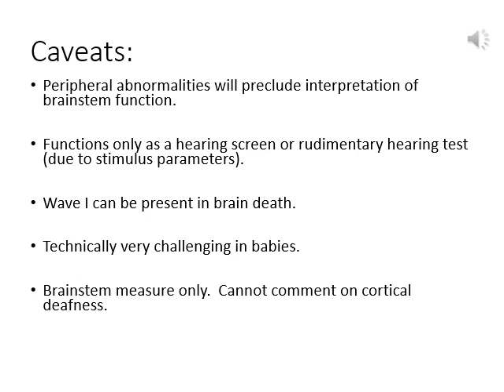Another caveat is the brainstem auditory evoked potential is a brainstem measure only. The normal latency of a wave 5 is under 10 milliseconds, and therefore only measures activation of generators in the brainstem. The BAEP cannot be used to comment on cortical functions or cortical deafness. Another recording protocol optimized for cortical responses must be used if there's a question of cortical function.